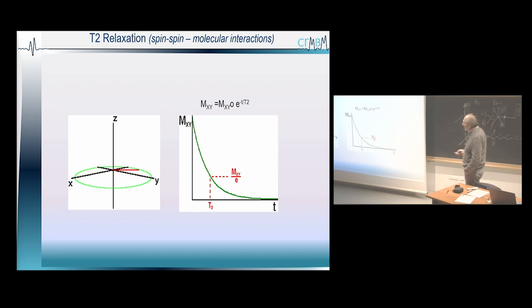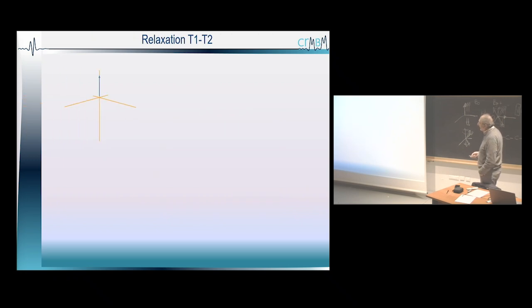And so you can imagine, okay, T2 means that you get a certain amount of signal. And so in terms of contrast, on the T2 you go from white to black on the image. Okay, but this is not interesting for now.